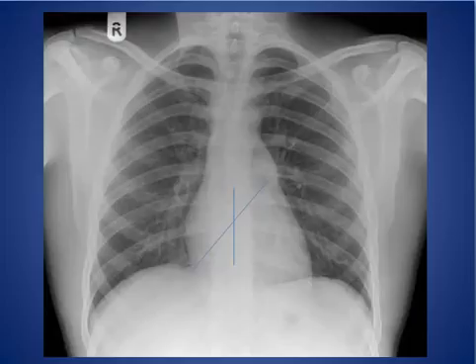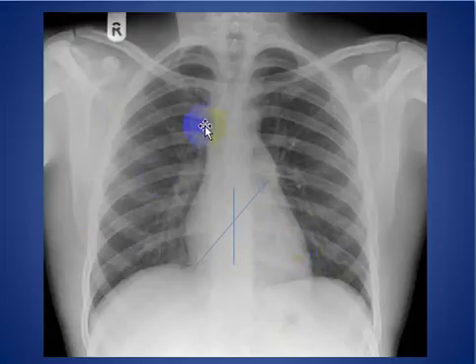This is the frontal chest X-ray of the patient. With a normal chest X-ray, you see the lungs are clear and the cardiac silhouette is within normal limits.